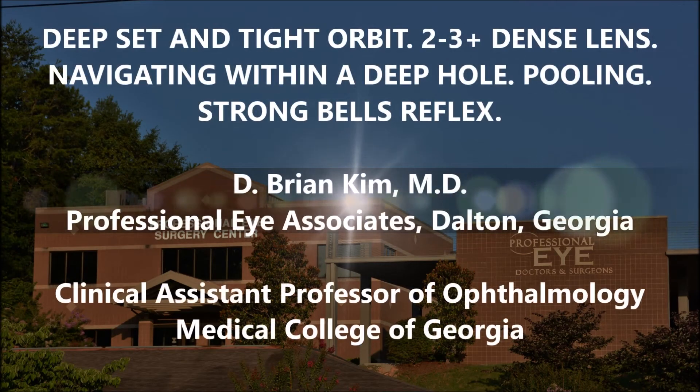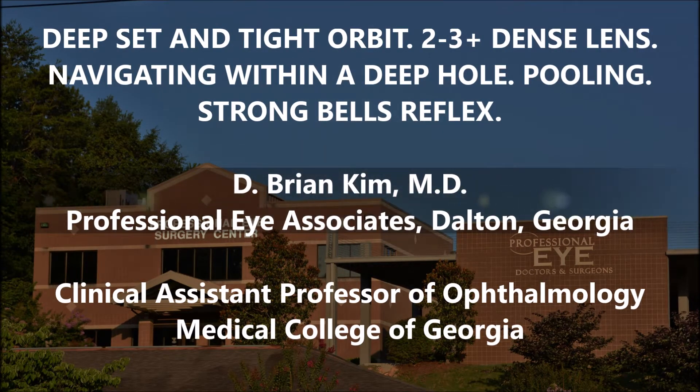Hi, this is Brian Kim. I'm going to share with you this case of a patient who has a 2 to 3 plus dense lens, and there are two challenging parts to this case. This patient has a really deep set and tight orbit, so you're feeling like you're having to work in a hole, and also this patient has a strong Bell's reflex.